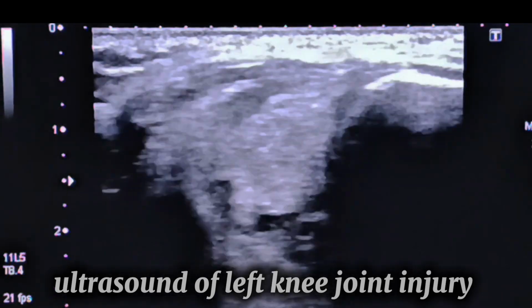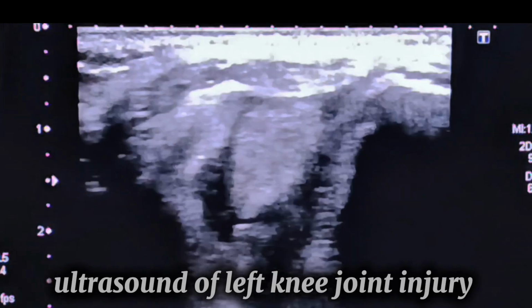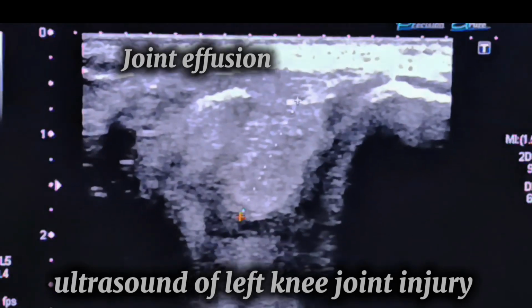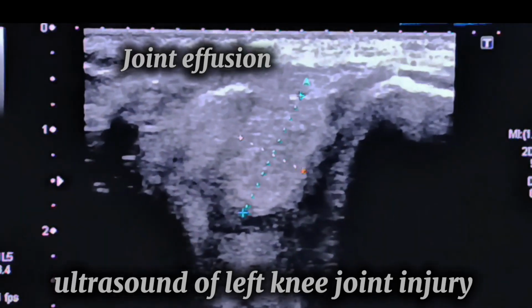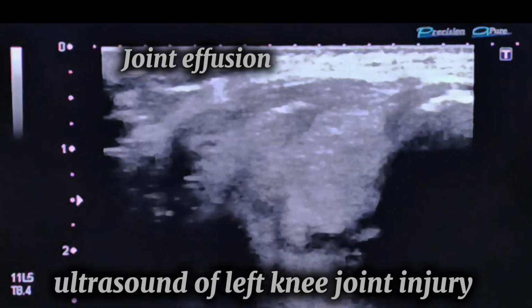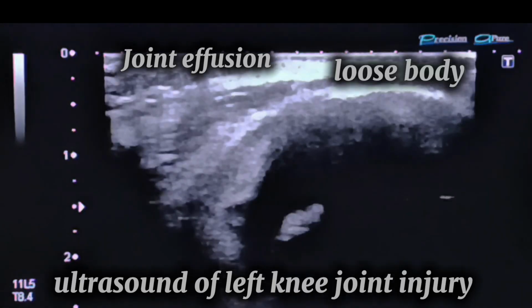A high-frequency linear transducer was used to focus on the lateral aspect of the knee joint. Joint spaces, synovium, and soft tissue were evaluated. Key finding was joint effusion and loose body, which was seen in the joint effusion. A well-defined echogenic structure was noted in the lateral joint space.